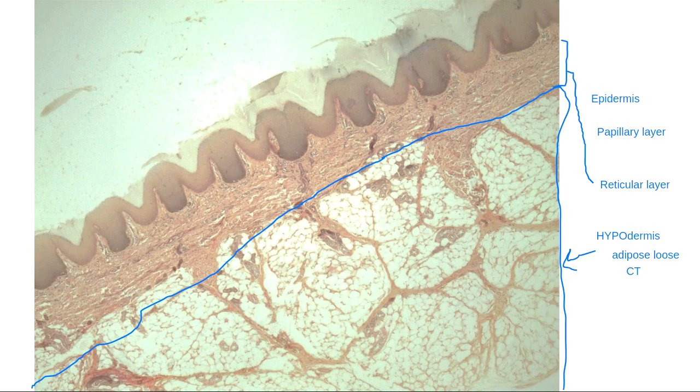The papillary layer is a lot smaller on this one, but I'm going to circle a little area for you to see, the papillary layer of the dermis. And this is one where the epidermis is super ugly and has those two colors again. The outermost layer that's completely dead is this light color, and then the more living layer is here in the darker color. All of this portion out here is the epidermis.